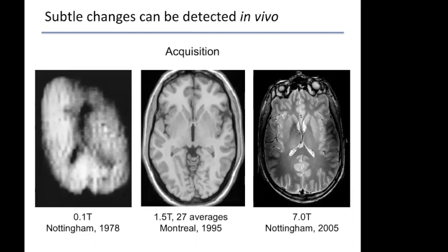Places that suffer from high amounts of signal dropout are places of high interest to us as imagers, which are often at the interface between gray matter, CSF and the skull. Those little pockets and rapid transitions between tissues create magnetization artifacts that we're still figuring out how to control and deal with.